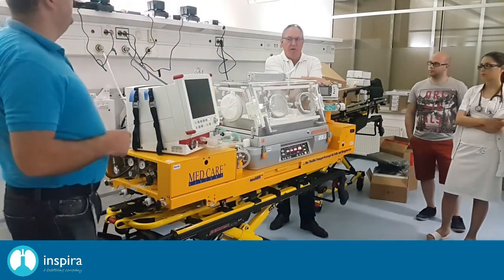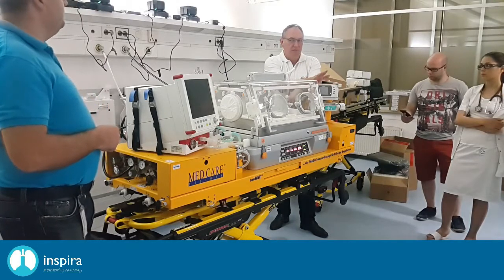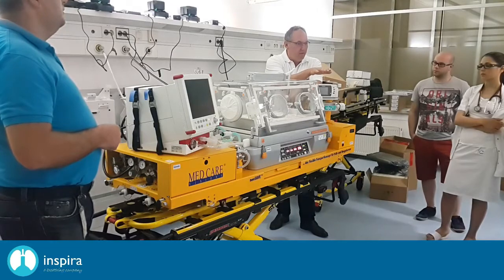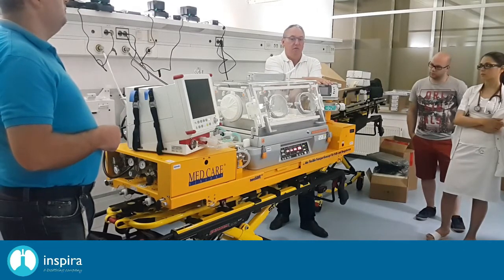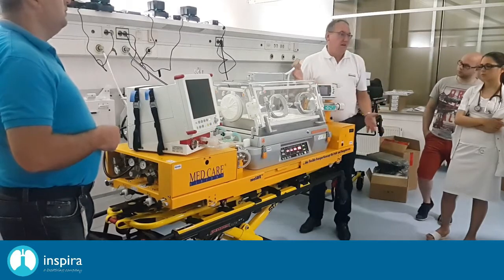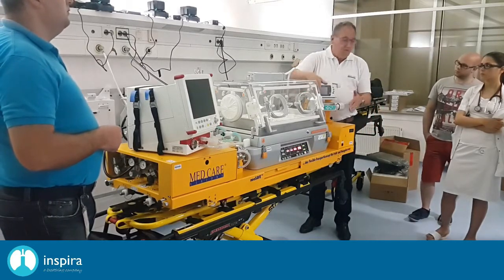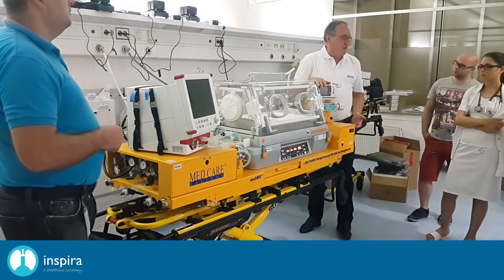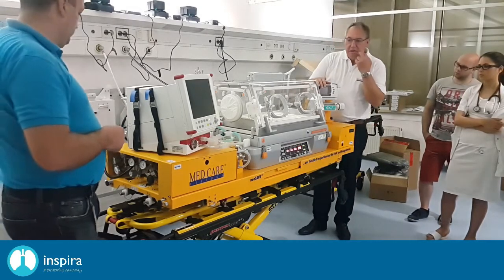Overheating is at 41 degrees. Yes. Okay? So this is quite important to understand, because in frequent cases people don't understand why it's not working like this here. You can't do anything. If this alarm comes, you have to switch off the system and it needs to cool down for a moment, and then you switch it back on again. Okay?